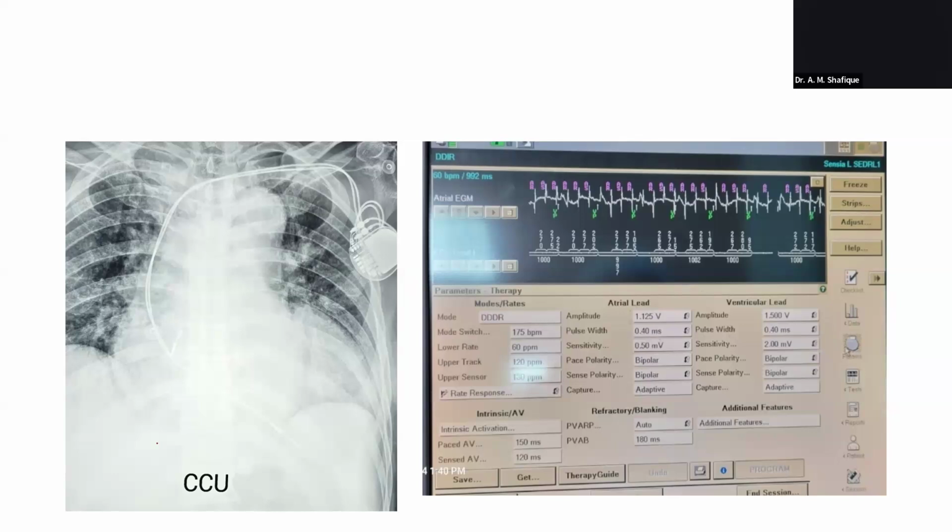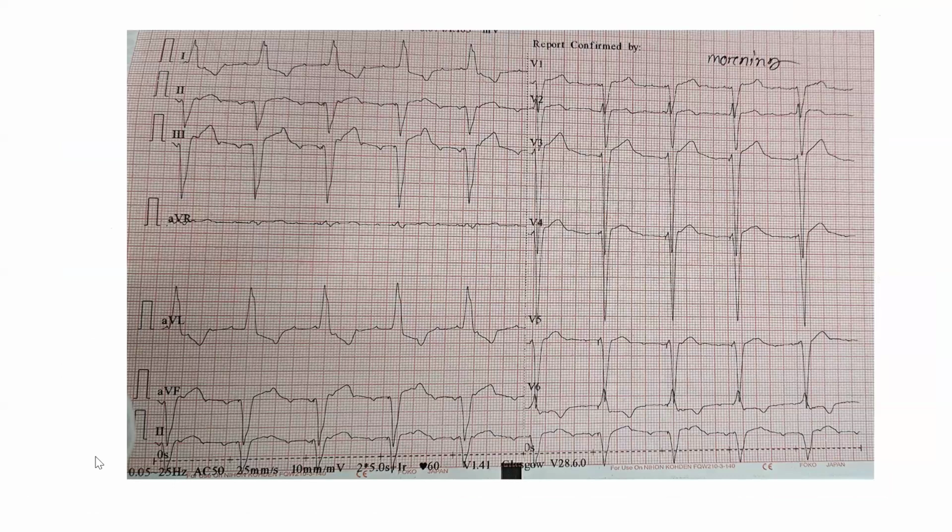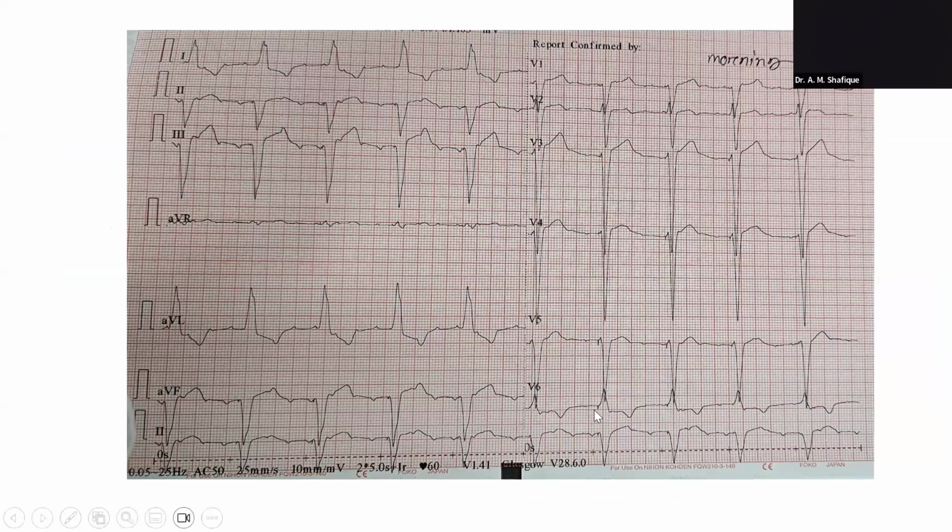So this is the interrogation. Can you show the ECG again, please? In the rhythm strip, there are spikes. Before most of the QRS complexes a spike is there, so one needs to see the spikes as well. But in clinical practice it is easy, because when the patient has a pacemaker, one knows and sees it on the X-ray. And here the atrial rate is around 230, so it is atrial tachycardia.